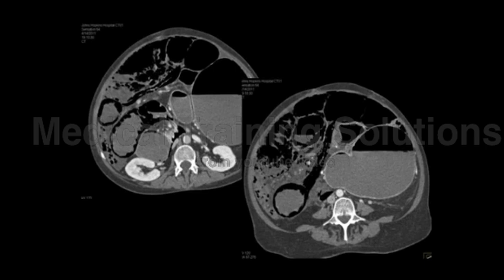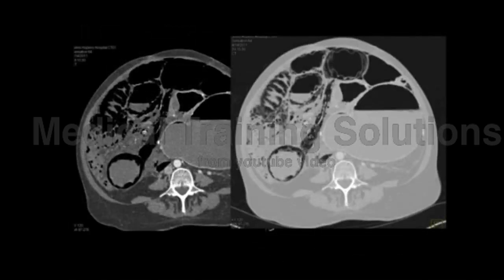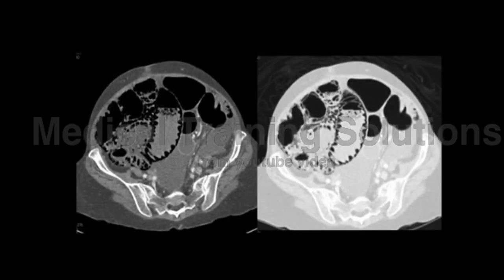Now, sometimes pneumatosis is hard to recognize. I don't think this is the case in this example. You can see the fluid in bowel and the air 360 degrees around it. If you're uncertain, just look at lung windows, and you can see how the lung windows really accentuate the pneumatosis. The extent of pneumatosis is better seen on these windows than on the soft tissue windows, and here's one more example. And you can see the beautiful pneumatosis.